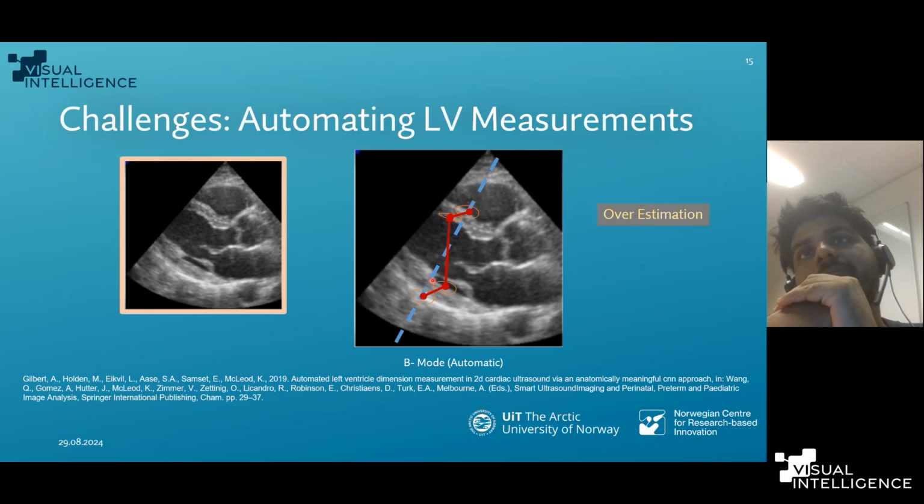But for left ventricle measurements, even though these are plausible landmarks, they have less clinical relevance as they are not correctly positioned, because based on these landmarks we might derive incorrect measurements due to imperfection of the landmark placement by the neural network.